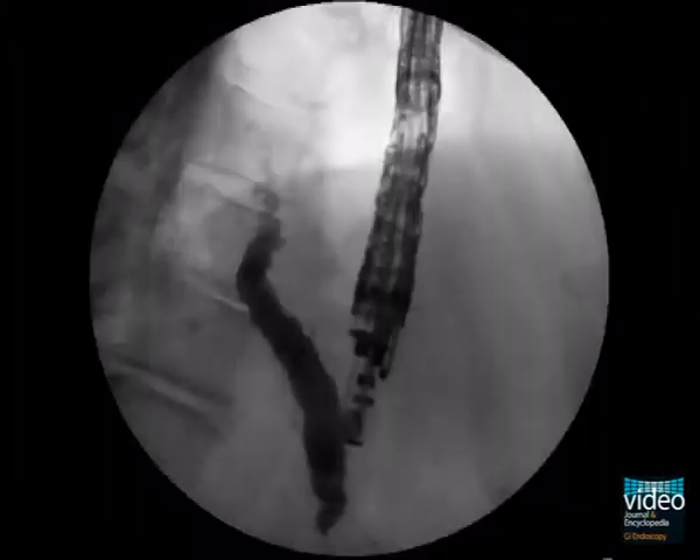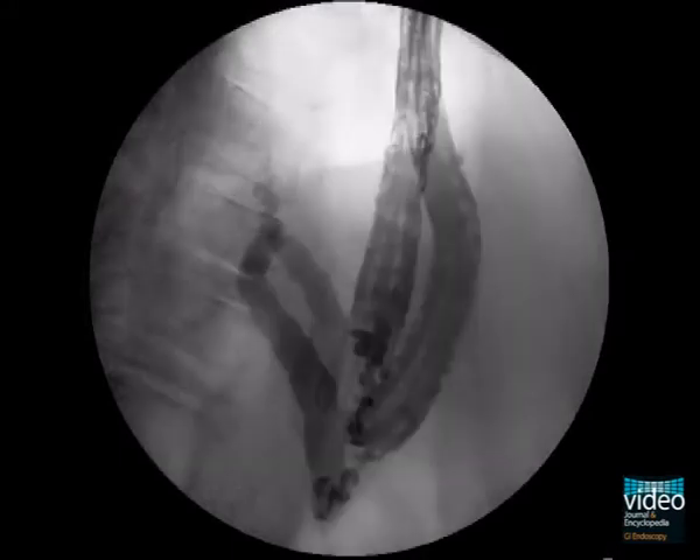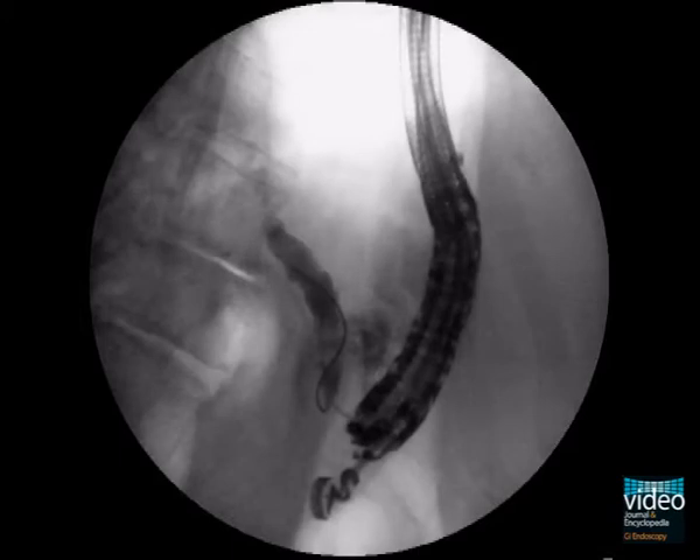Applying contrast media via the needle into the pancreatic duct, control fluoroscopy confirms the dilated pancreatic duct and absent drainage through the papilla, indicating complete obstruction of the pancreatic duct.